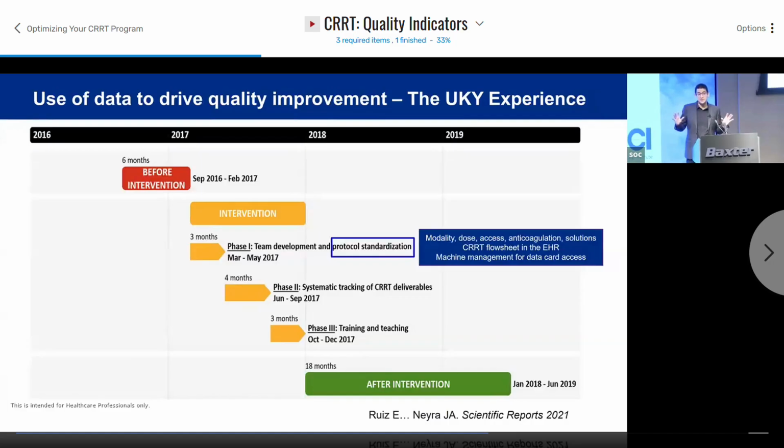We said, okay, if you administer our machines, you can create a report about utilization that will help me to understand when we are in need, or how many times we're above 80% of capacity. And if that's very frequent, then perhaps we need more machines. So that's an informed decision, right? It's not, oh, I think I need a couple of extra machines, why don't we get a couple more? Do you really need them? You may need them or not. So the resources are there, but sometimes there is a need to orchestrate, so everybody talks the same language, and you can, in the best interest of the program, create positive change.